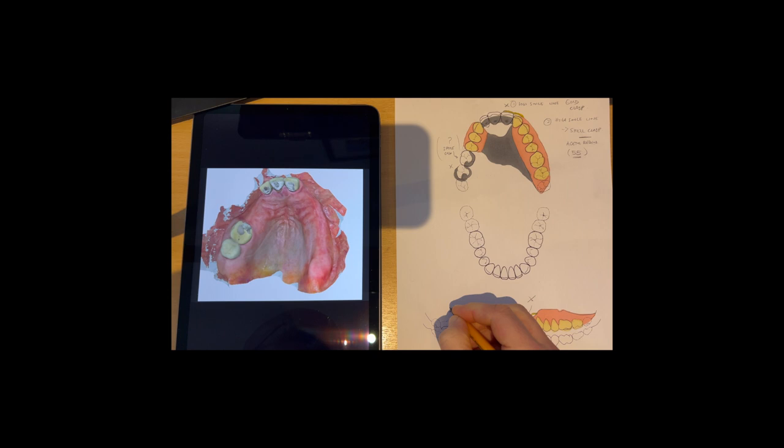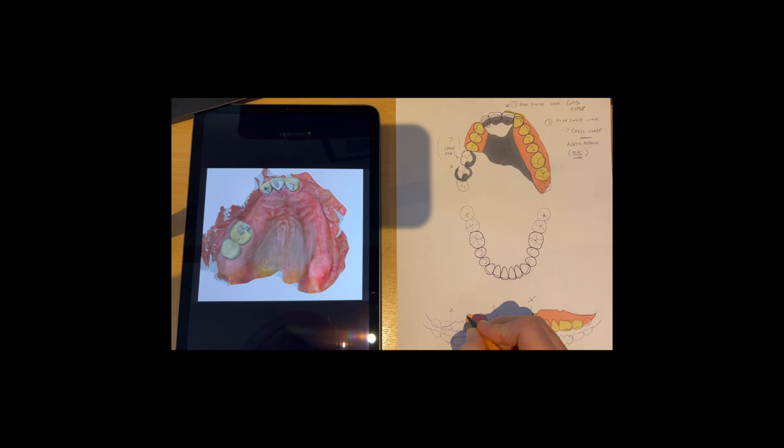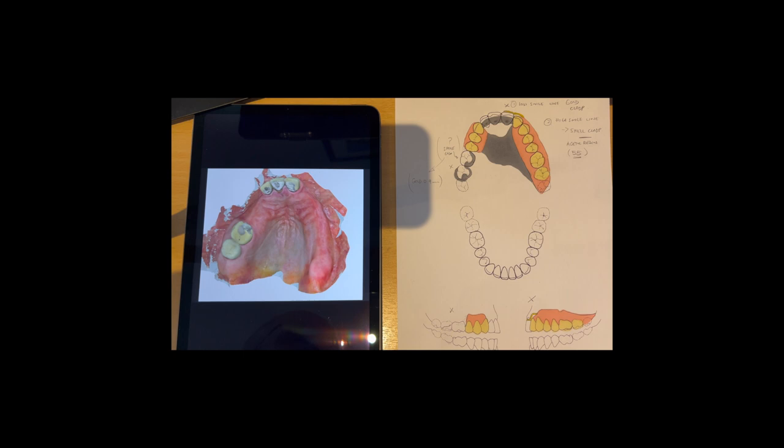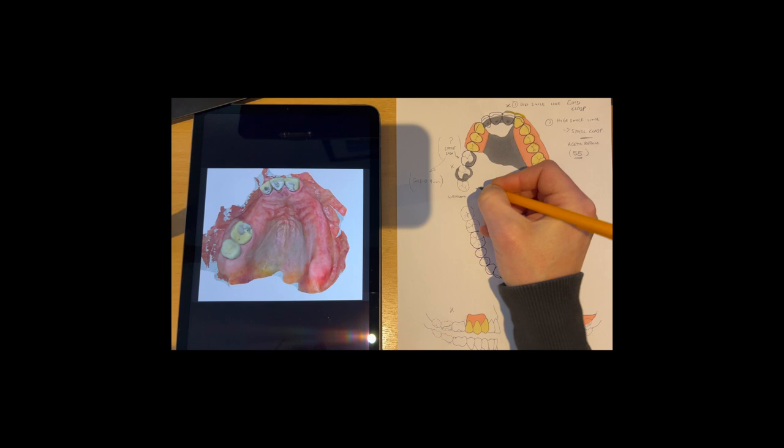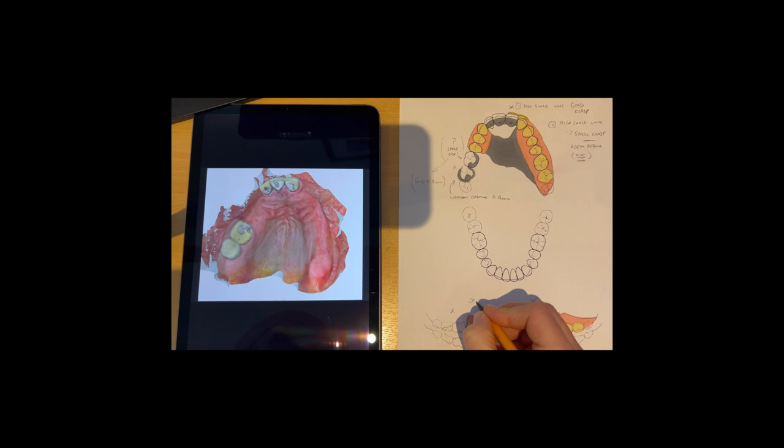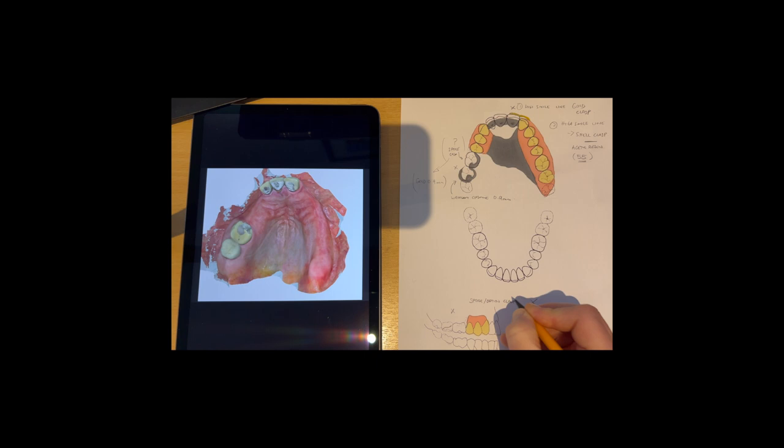So this here, we've got a clasp arm coming around here engaging that mesio-buccal undercut just on there. We could also have an optional clasp if need be just coming off there. That could be a spare clasp, that would be gold 0.9 millimeter there for that spare clasp. Now this is a wrought chrome clasp, 0.9 millimeter just there. So that's your potential spare 0.9 millimeter slash optional clasp just in that position.